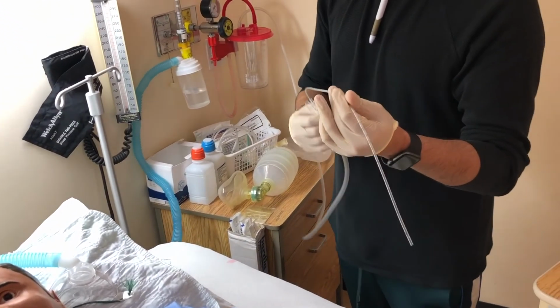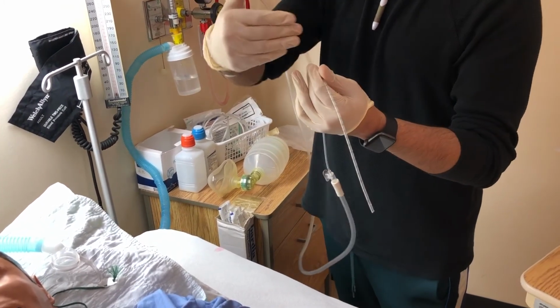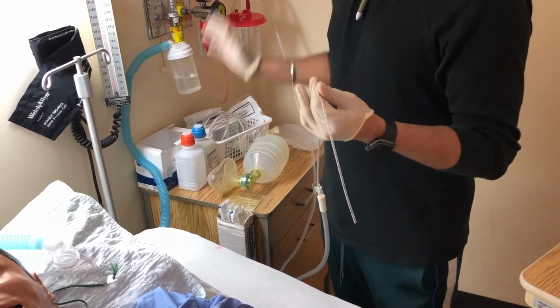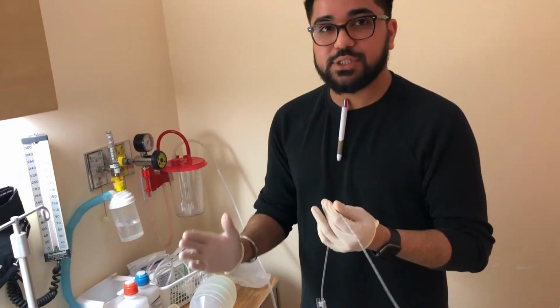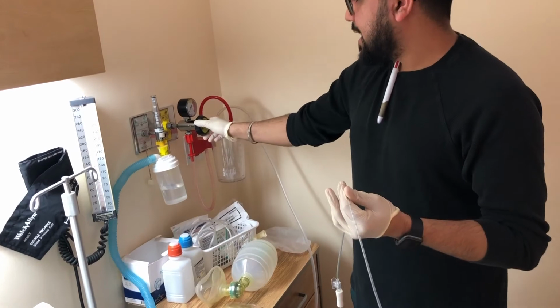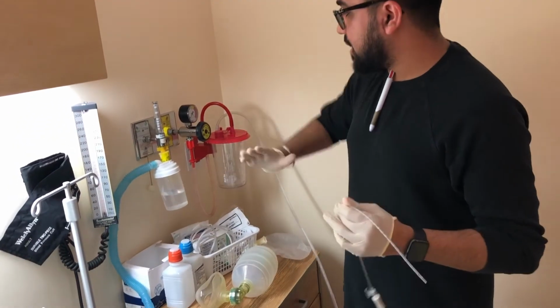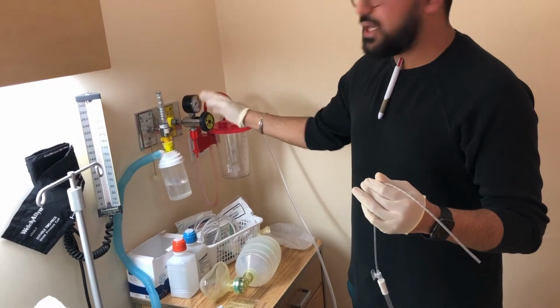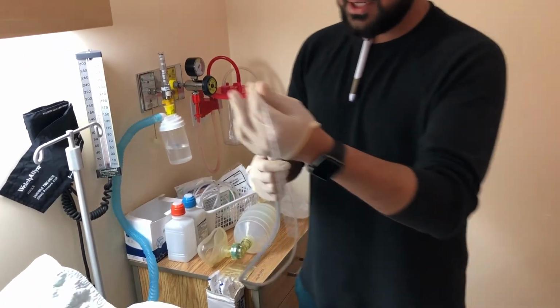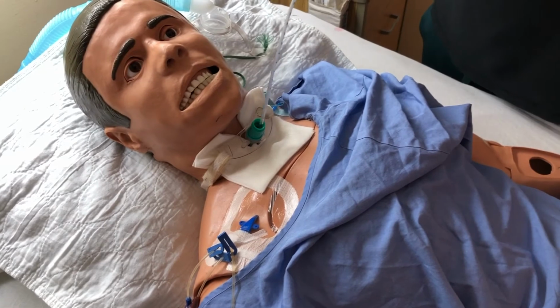And you want to start suctioning while it's inserted in the bifurcation, or when your fingers reach the end of the thing over there. So we can increase our suction. Your suction should be at 80 to 120, which is within the medium range. So what would happen is, if the suction was working, it would be low, but then the second you press here, put your finger and cover this up, the suction would go between 80 to 120, and we could say for this case that it is between 80 to 120. So now I would insert this into my patient, just as such.